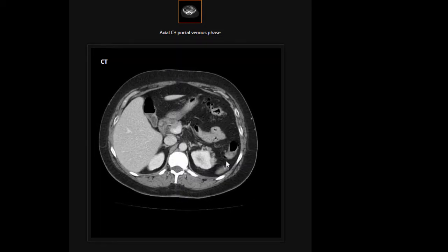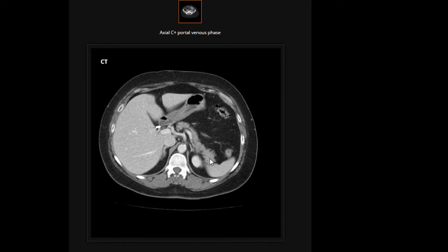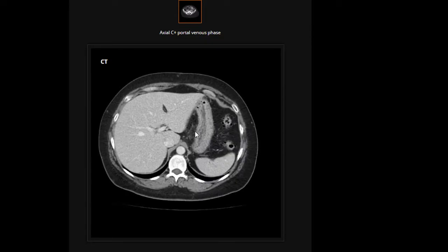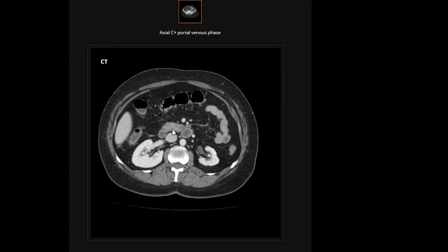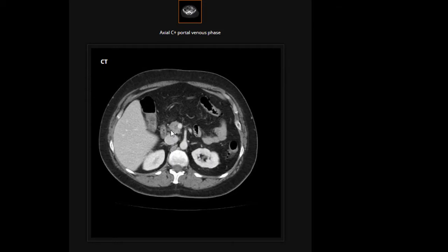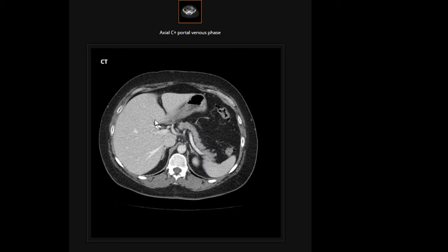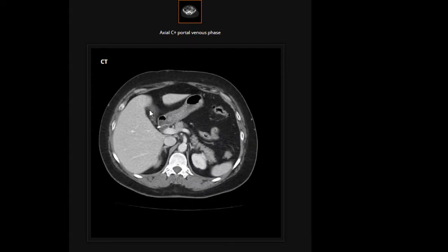Then we move to the spleen, which looks normal. We look for the pancreas, we look for the pancreatic tail and the splenic hilum, and we follow it towards the midline, and it looks normal. And we can see here the extrahepatic common duct coming up towards where the gallbladder would normally be, but here we see cholecystectomy clips in a patient who's had her gallbladder surgically removed.